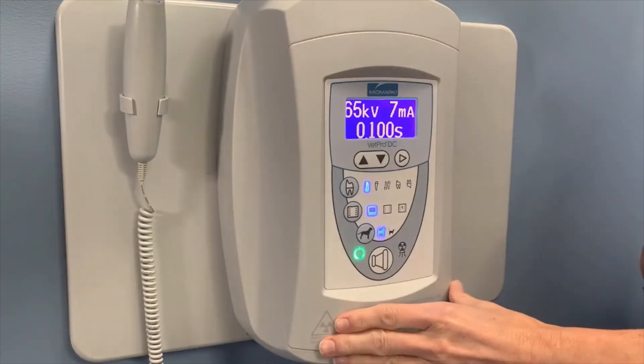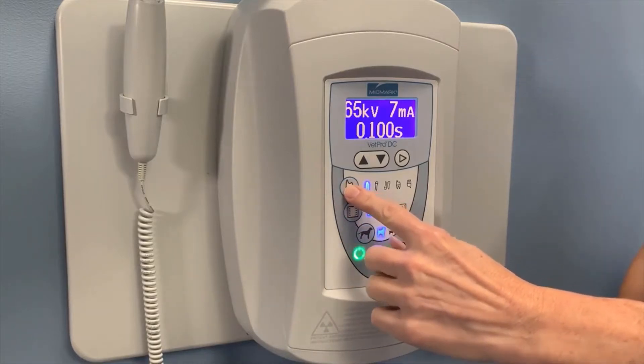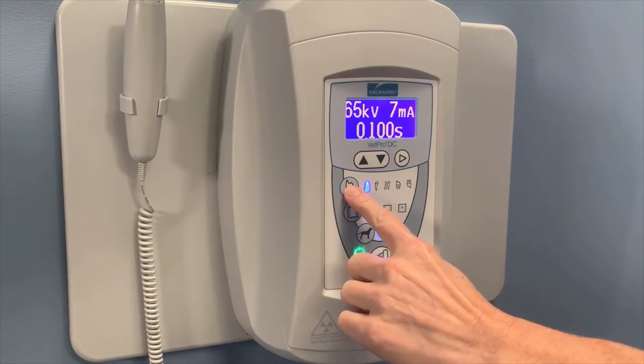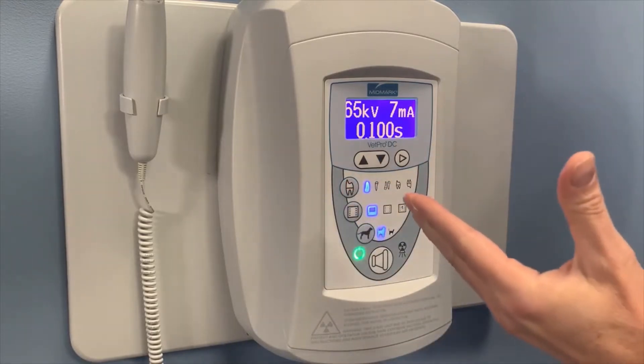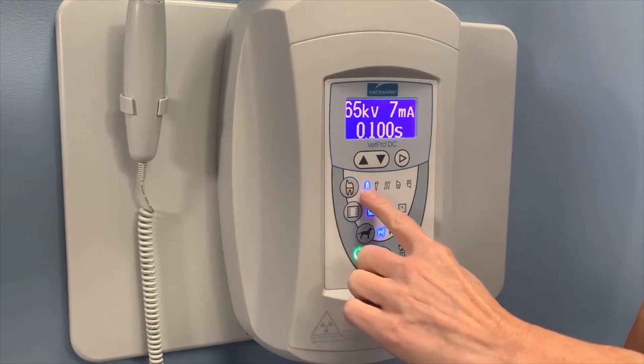Here is our operator panel. Let's take a look at the tooth selection options. Whatever tooth you select on the machine, it'll automatically set itself for that area of the mouth. The first tooth is the lower canine.